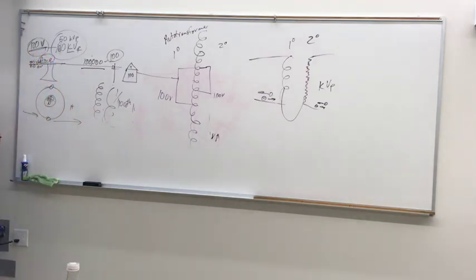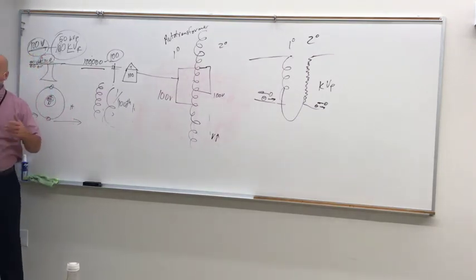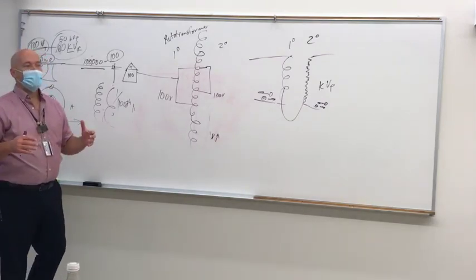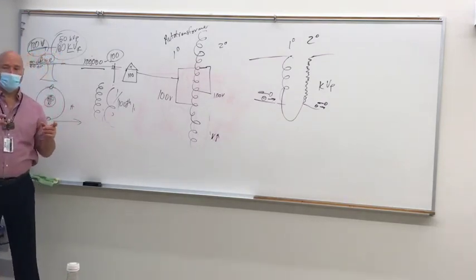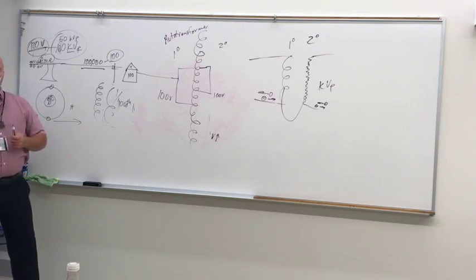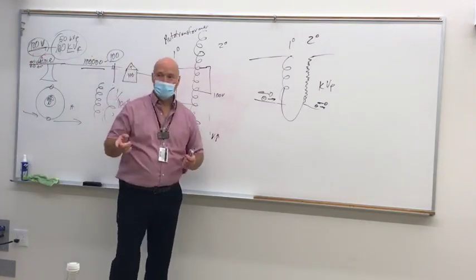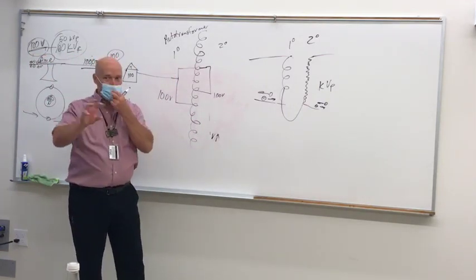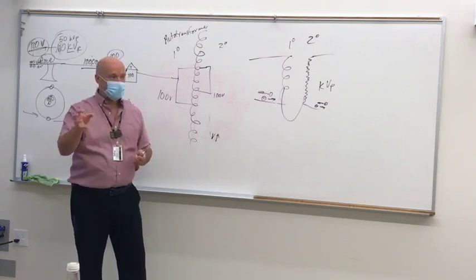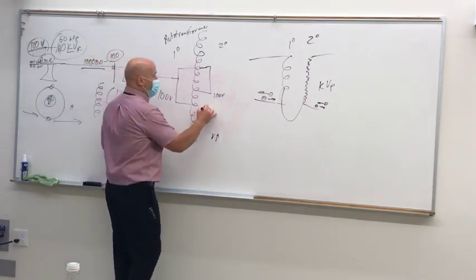that is basically a rheostat. Okay, you know what a rheostat is? You use them all the time. Like a thermostat? Yeah, a thermostat is a type of rheostat. It's something that controls electricity to the point where you can increase or decrease something incrementally. Is it like the thing on the side of your house that people fix? The thing that spins? No, that's just a meter. Where you see a rheostat is, do any of you have a knob on the wall that you can turn the lights up or down with? Mhm. That's a rheostat. That's all it is. So an auto transformer is a type of rheostat.